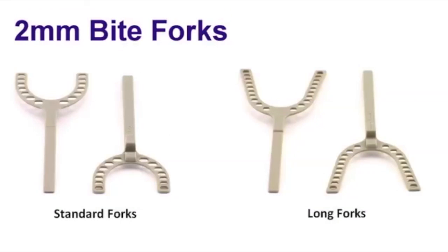The 2mm fork is ideal when you are taking your records for the Narval CAD-CAM appliance. Otherwise, most of your colleagues will utilize the 2mm incisal clearance on some of those deep bite cases where you need a little bit more flexibility than the white 5mm fork will give you.